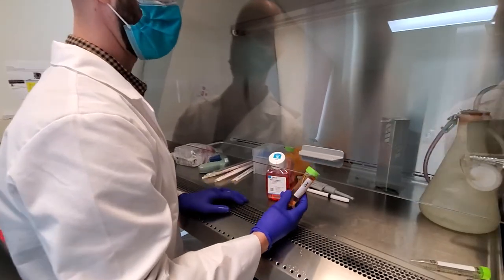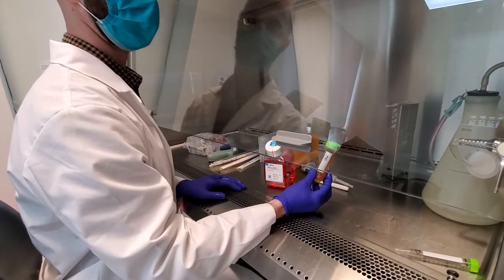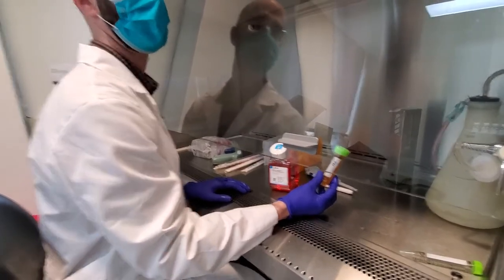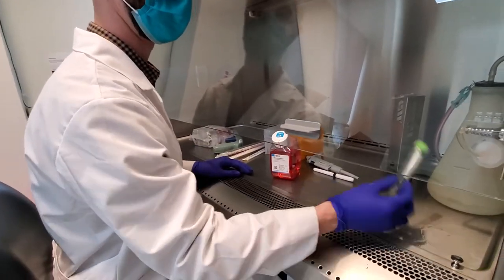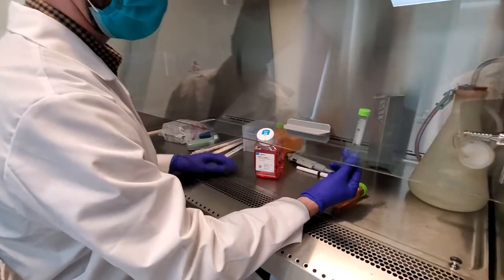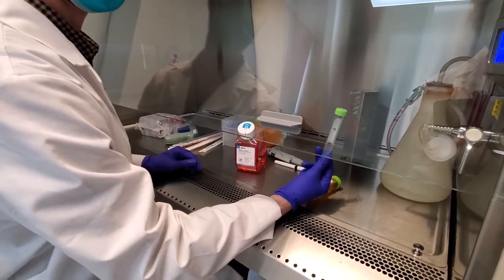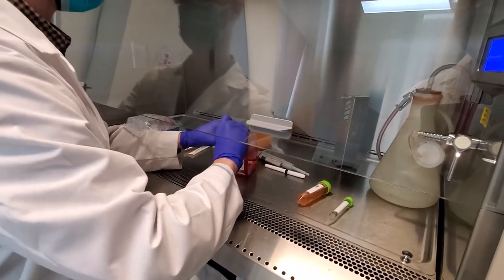So technically, it's whatever 50 is of 550. I can't do the math in my head anymore. Yeah, so it's a little less than 10%. Same thing with this: this is 5 mLs going in here, so we could take out another 5 mLs and it would be 1%, but I just add it in. So it's a little bit less than that.